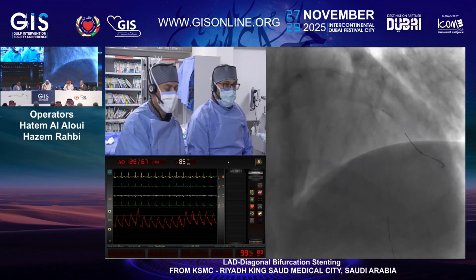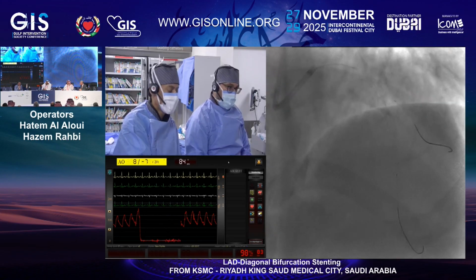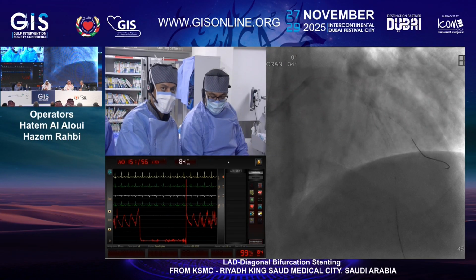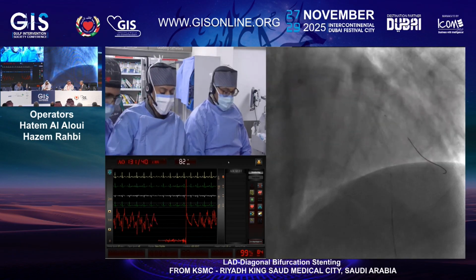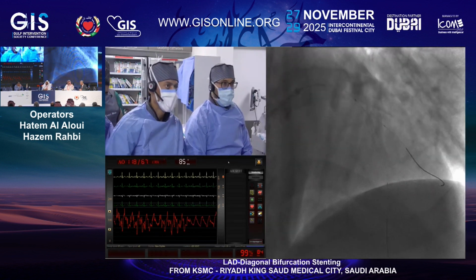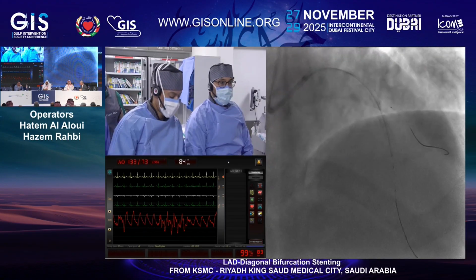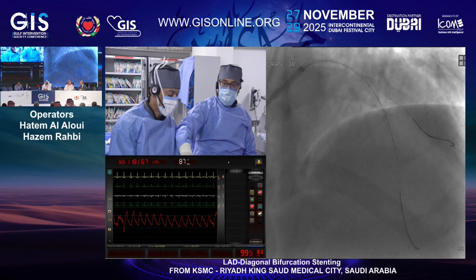Well, I know in your center you do a lot of imaging. Do you favor IVUS or OCT? I was in OCT. We know that with OCT we have better resolution, but it's at the expense of the contrast amount. Still, I'm doing over 90% of my cases imaging based.